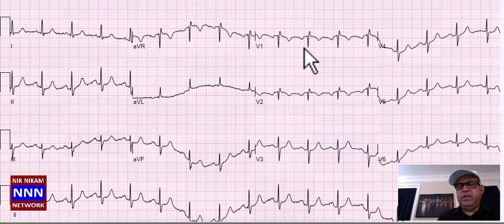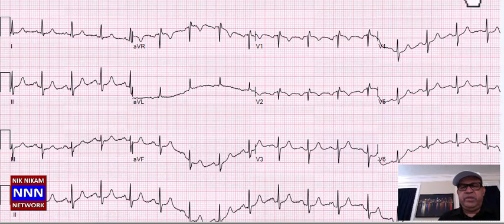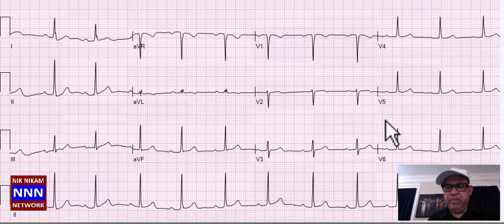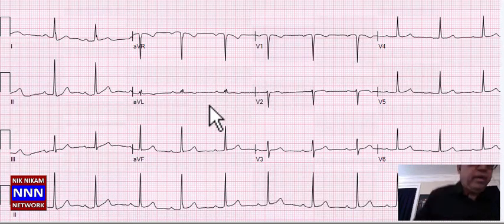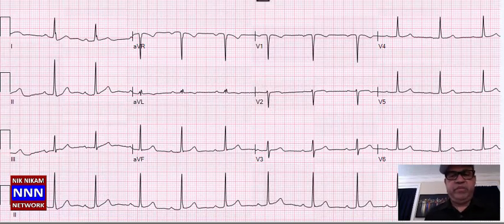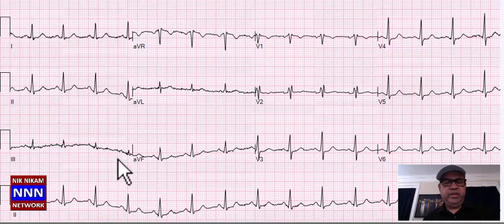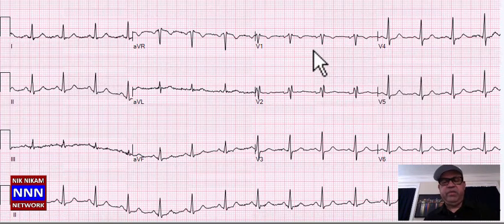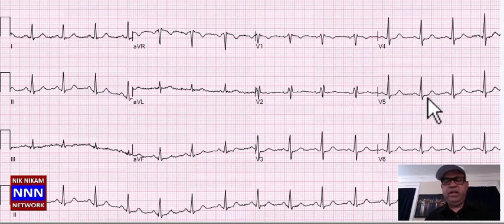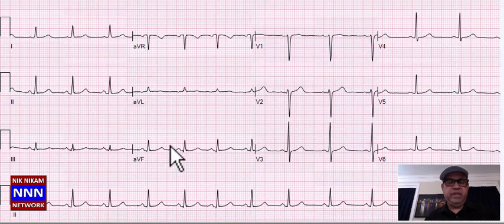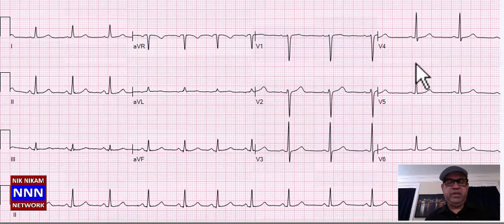Normal sinus rhythm with incomplete right bundle branch block and no significant ST-T changes. Next: sinus rhythm, loss of R-waves anteriorly, lateral leads okay — possible old anterior infarction or lead misplacement. Sinus rhythm, inferior region with some non-specific T-wave changes, incomplete right bundle branch block, nothing really significant.